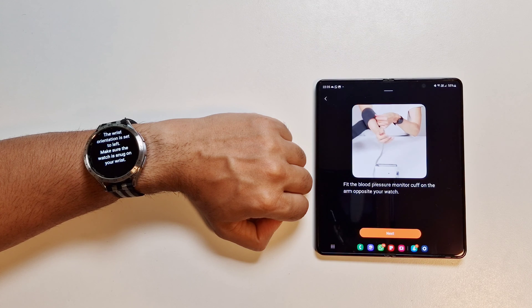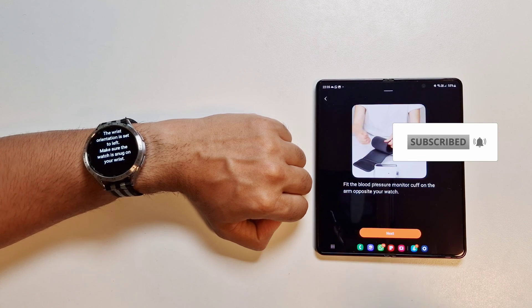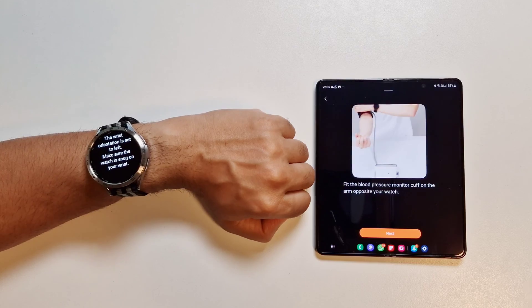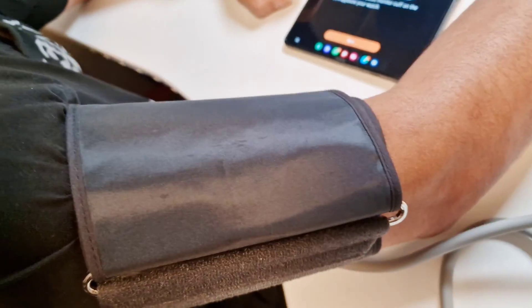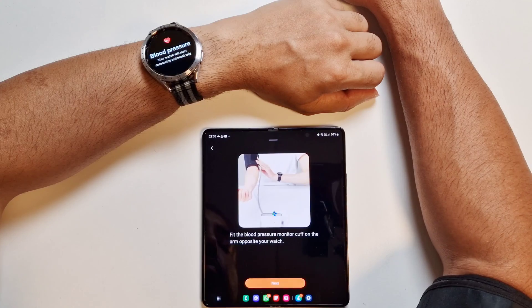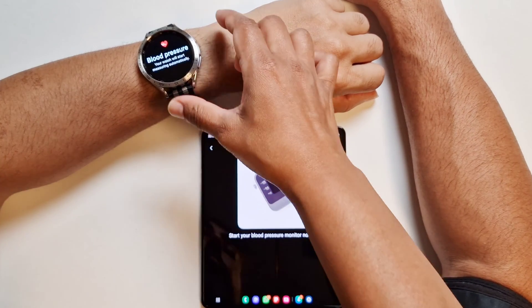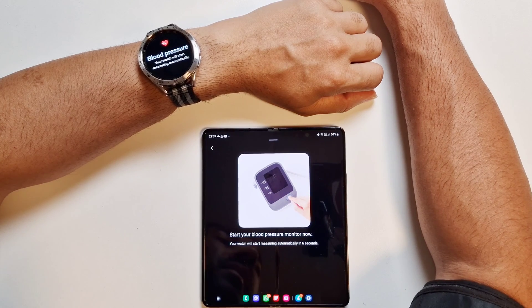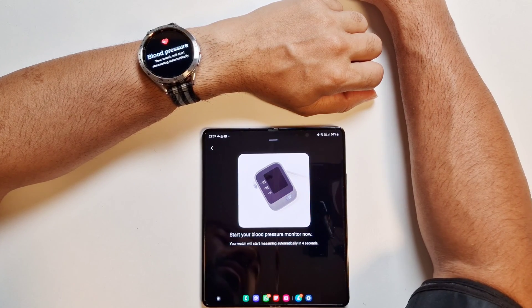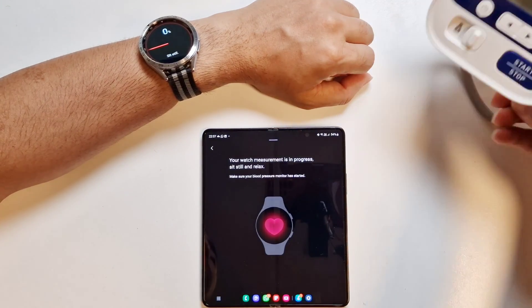Fit the blood pressure monitor cuff on the arm opposite your watch. So if you have your watch on your left, put the cuff on your right. I'm going to do that now — we've got the cuff on the upper arm. Now start your blood pressure monitor. On the watch you've got the blood pressure instruction, and your watch will start measuring automatically.